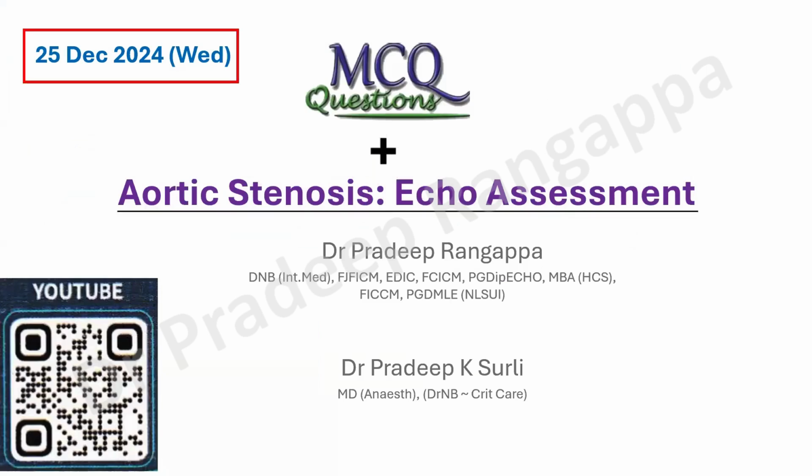Morning, friends. Today I'll be giving a brief overview on the echo assessment of aortic stenosis. I'm sure many of you would have listened to the video on the aortic stenosis overview and what an intensivist should know, which I did around a week back. As a continuum of that, I'm doing this echo assessment mainly from the intensivist standpoint. What are the key things that we look at when we are assessing aortic stenosis with an echocardiogram?